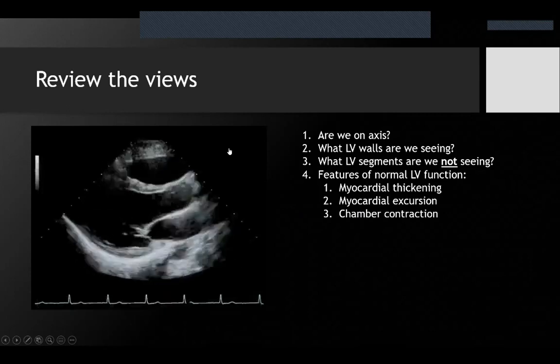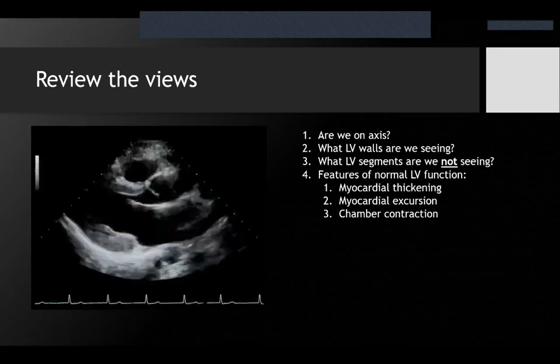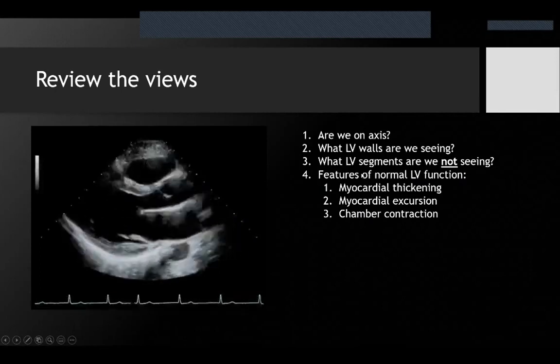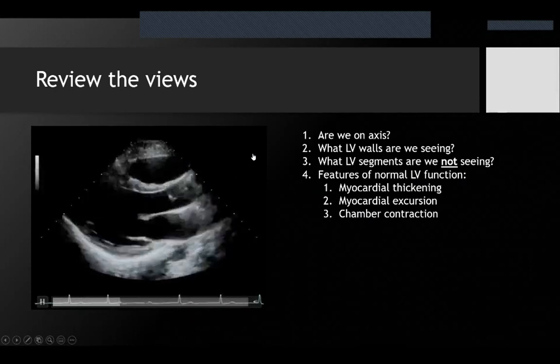So you'll see whatever you think on this view, and then you'll look at the other views, which we're about to go through, and you'll ask yourself whether the things that you've seen on this view are corroborated on the other views, or maybe the different segments that you're not seeing here are behaving differently, which you'll be able to capture on other views.